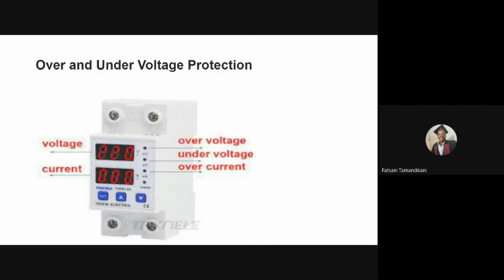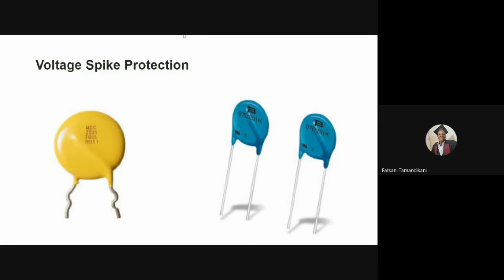Secondly, we are going to look at how we can protect our oxygen concentrators from voltage spikes. There are various types of protectors for large voltage spikes. Some divert the current to earth, thereby shorting the current, and others dissipate the current as heat. The most common approach to protect concentrators from voltage spikes is incorporated right on the board in the form of an MOV. MOV is an abbreviation for metal oxide varistor. MOVs are a very common product used to protect oxygen concentrators from voltage spikes.